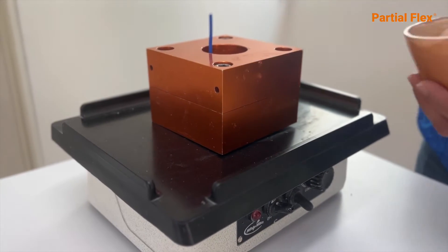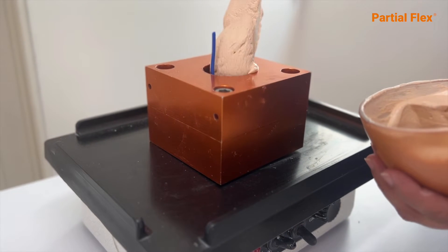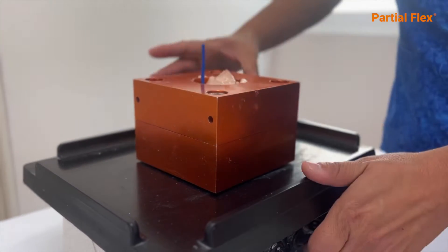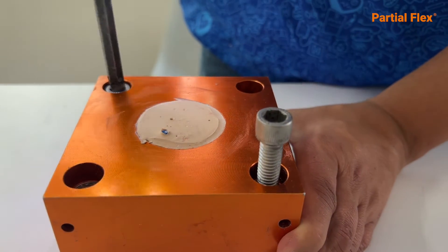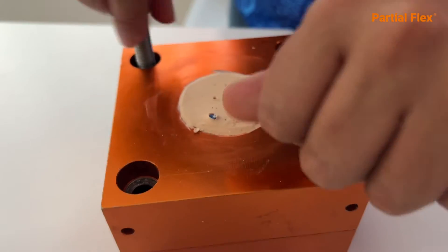Take the flask to your dental vibrator and fill it with partial flex plaster to the top. For the lower half of the flask, use 230 grams of well-spatulated partial flex type 4 plaster. After 60 minutes, open the flask. Remember at this point we are using only two screws.